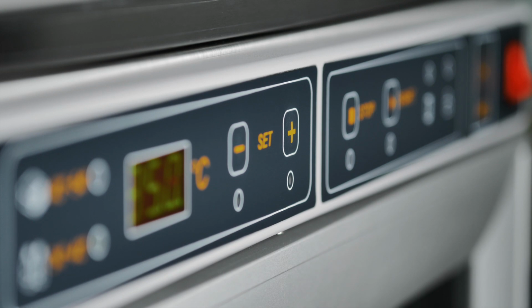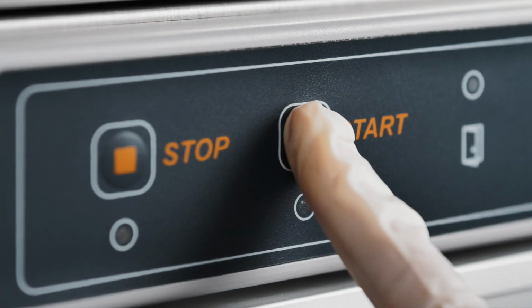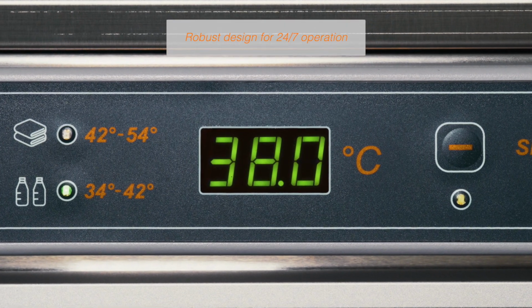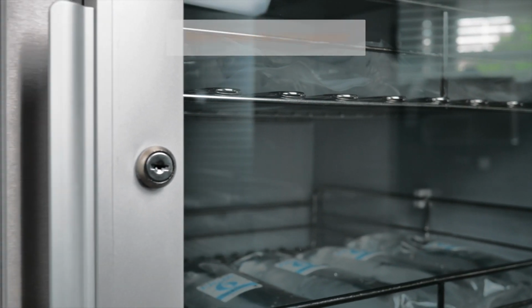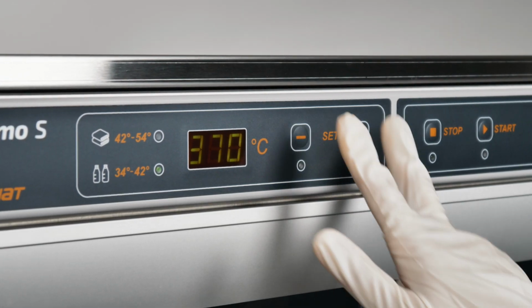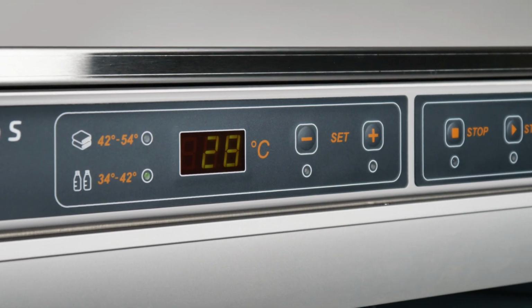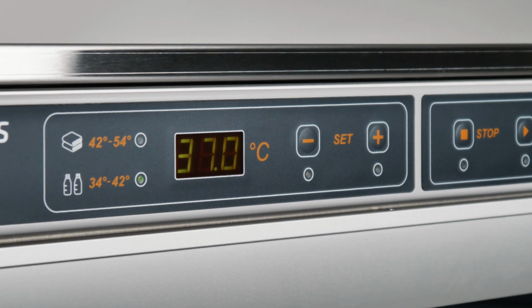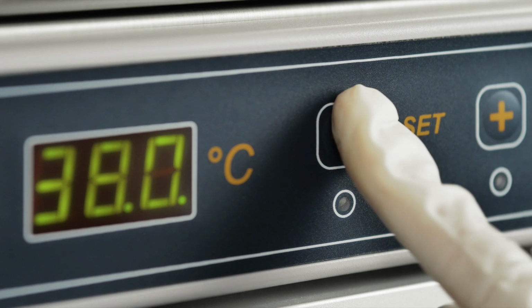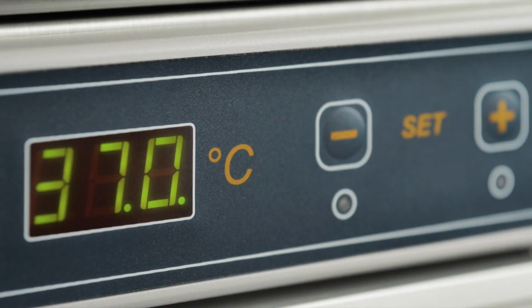To start heating, press the start button. After reaching the set temperature, the device will automatically maintain it 24 hours a day. The simultaneous pressing plus and minus buttons displays the time counter. For changing the temperature, press the stop button. Set the desired temperature and press start.